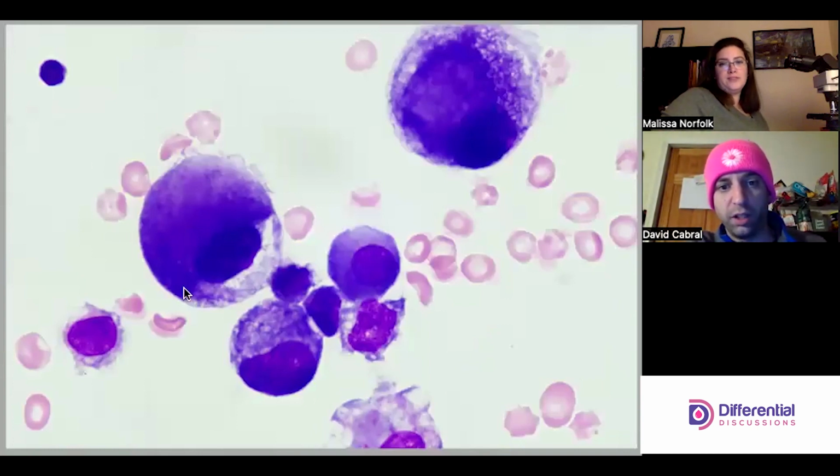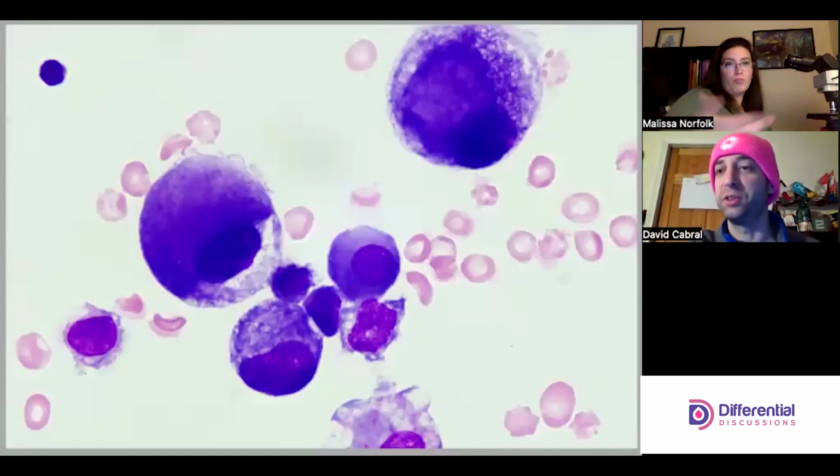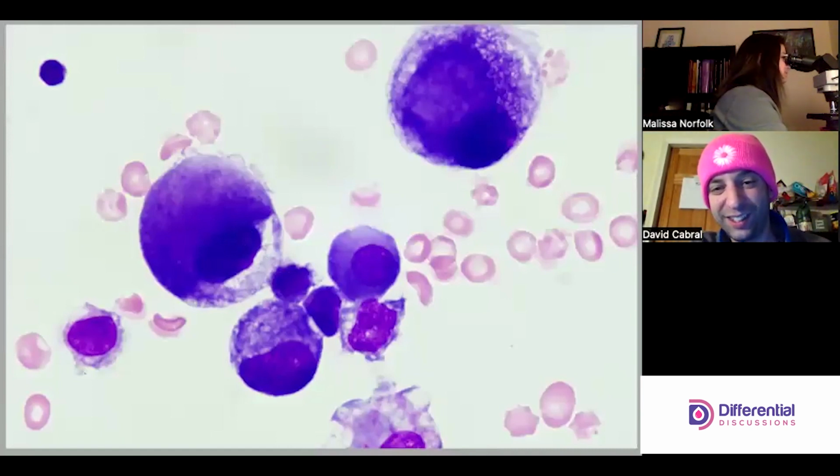Yeah, so a lot of troubling stuff. The staining pattern here where it's super dark over here and really light over there. Yep. And then like this one, looks okay, but then it's doing the staining thing like the bad guy. So then it gets guilty by association in my mind.